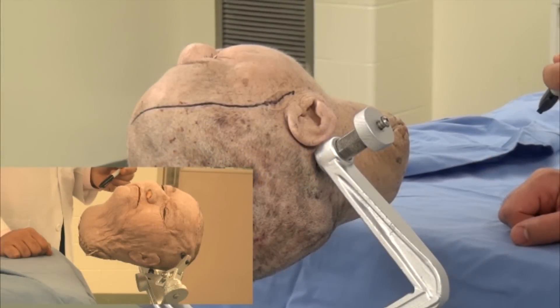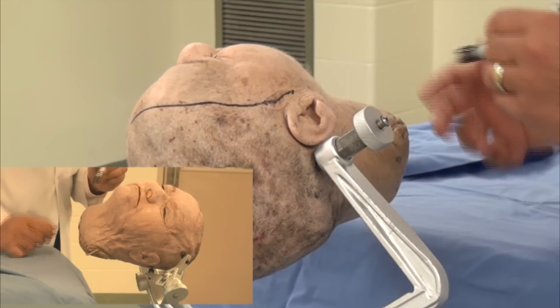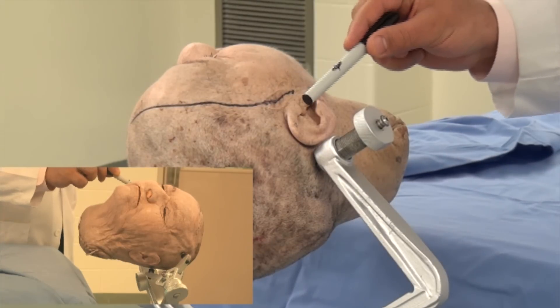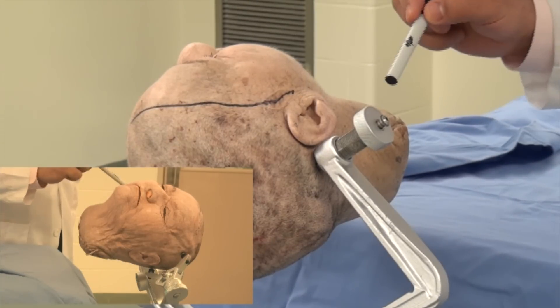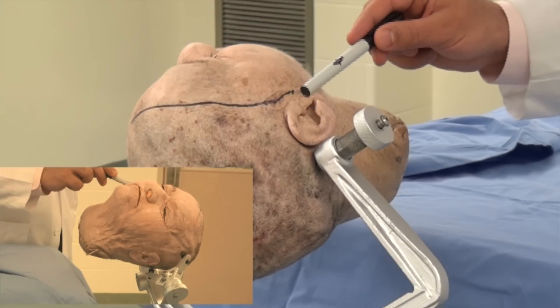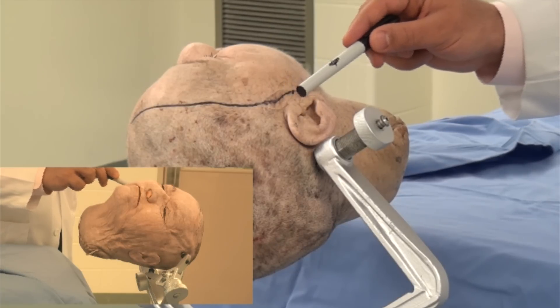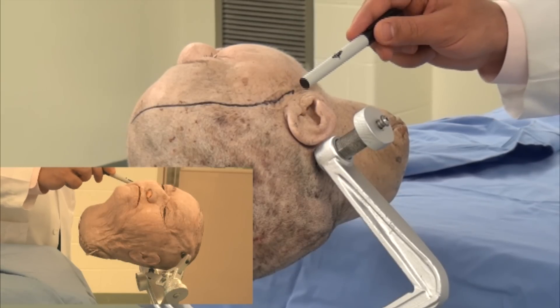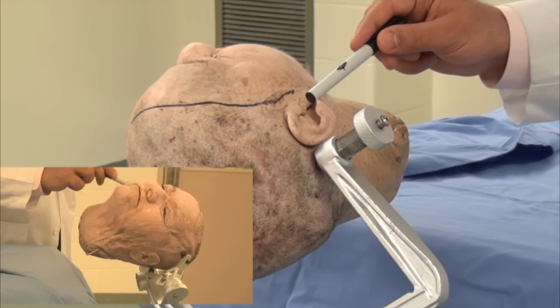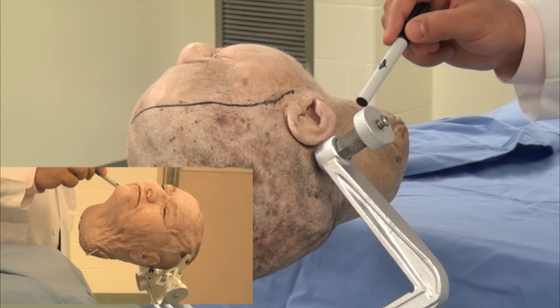Let's review the incision for pterional craniotomy. The incision typically starts a centimeter anterior to the tragus. This is to avoid the superficial temporal artery that is usually within the first centimeter of the tragus anteriorly.